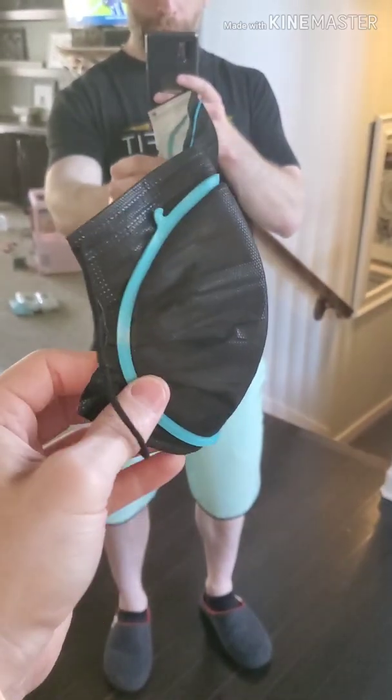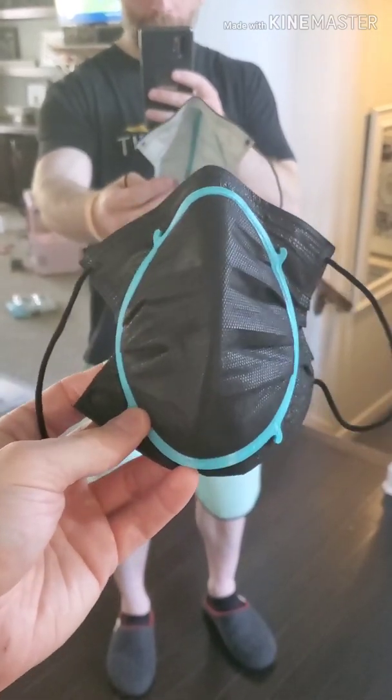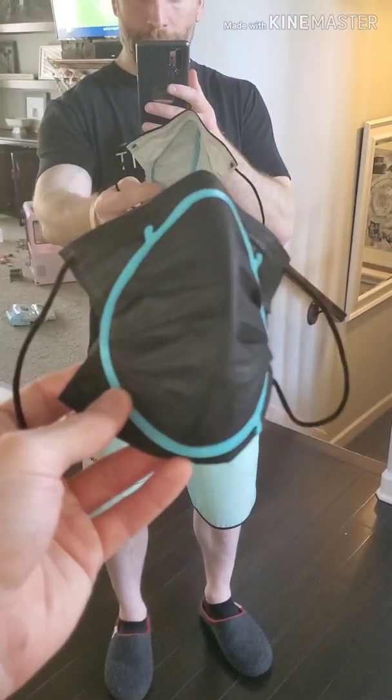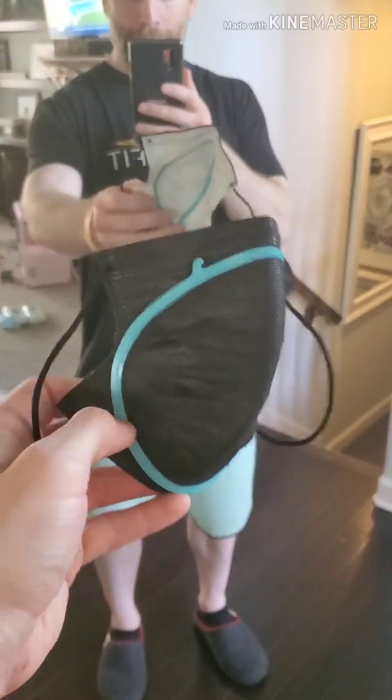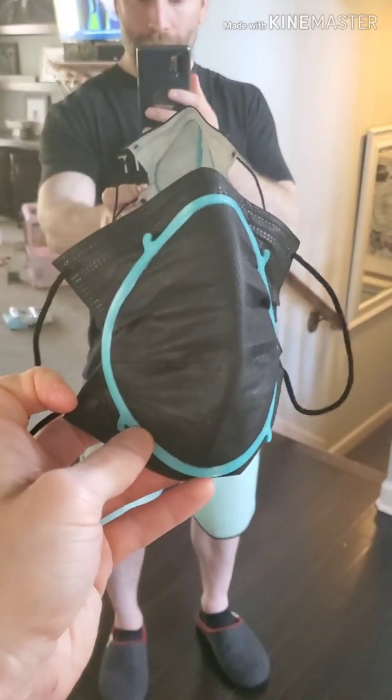There's an outer one that keeps it secure against the face. The first place I saw a printed mask frame like this was Bellus 3D. If you use their iPhone app, the Bellus 3D face app, you can take a face scan and then it will generate a file that fits right around your face, which is awesome.